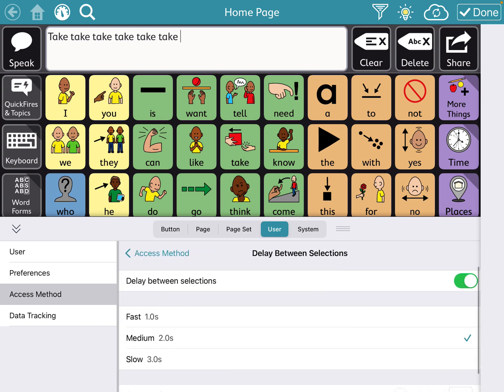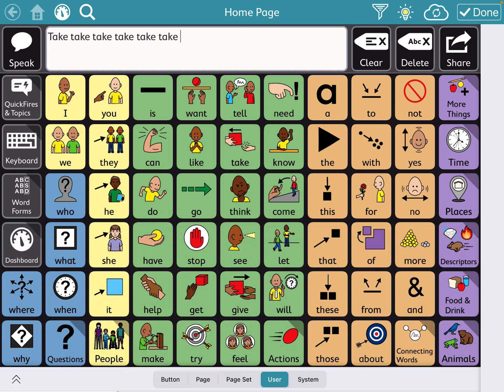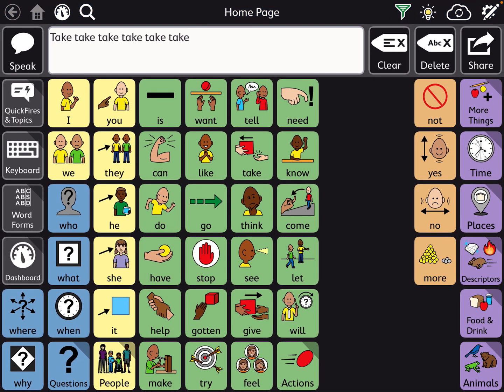I'll show you what medium looks like for that same situation. Take, take, take. So now there's multiple times. It's like delay is about two seconds. If that's too slow, change it to one second. Play around with it. But this will help decrease that multiple button press.